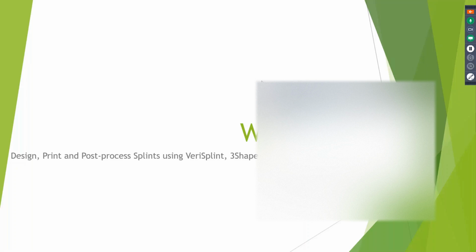Delmar says 4 minutes seems to be too much. No, 4 minutes is what we found to be sufficient and comparable to the auto flash. Delmar again says it makes them too dark and hard. Can we do 2 minutes? You can experiment and do 2 minutes, although we cannot guarantee that it won't break or that it's going to function properly. But like I said before, the auto flash is definitely the recommended curing unit.